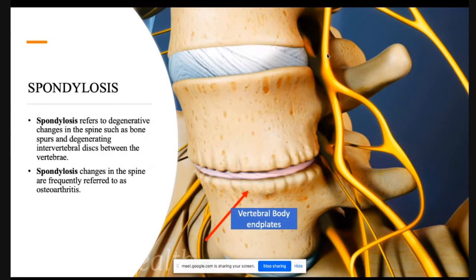the most repeated terms everyone will be hearing and writing in the diagnosis are spondylosis, spondylitis, spondylolisthesis. So what exactly is the mechanism? See the picture. You can see in the upper one the intervertebral disc and the surface of the vertebral body is smooth. There is no damage. In the second picture, where I have shown with an arrow mark, you have some ridges over the vertebral body. This is called end plate changes, in the upper end plate and lower end plate.